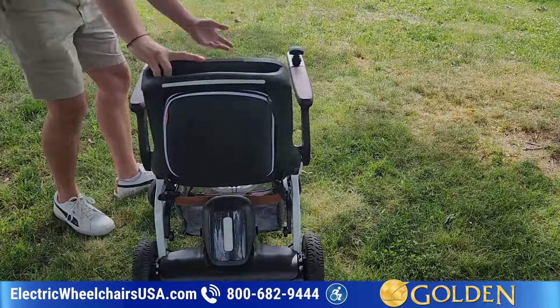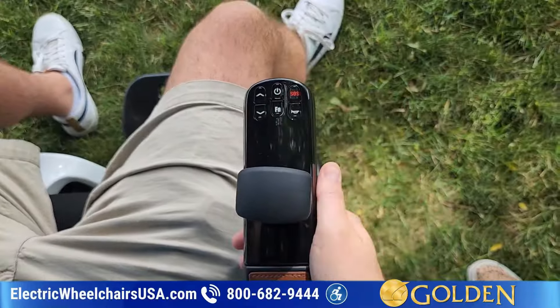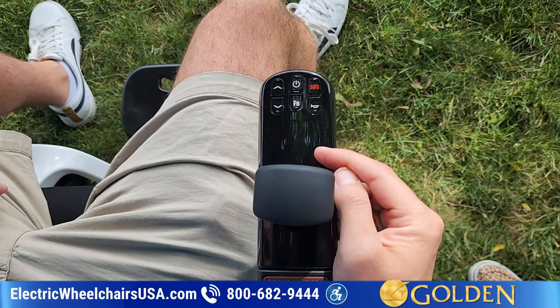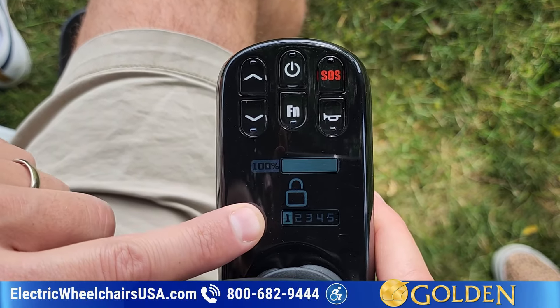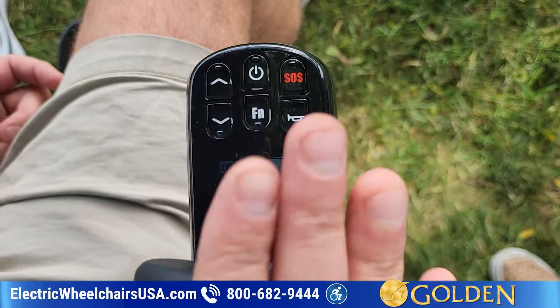As far as some of the features, this is really a unique, state-of-the-art chair. To turn it on, here's the power button — you have to hold this down for five seconds. You can see it kind of looks like little eyeballs that showed up. It's 100% charged. There are five speeds and it's currently on speed one. Right now it's in the locked position, so you can't operate it.